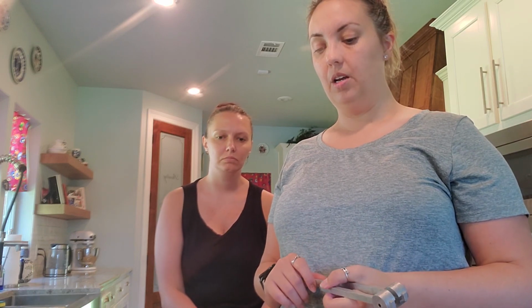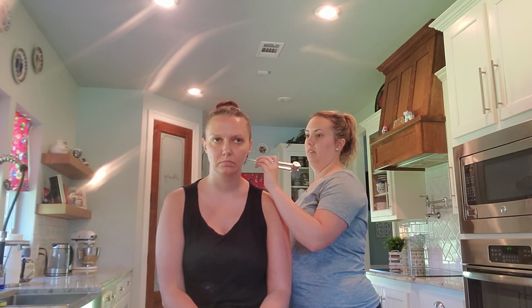Now the Rinne test. I'm going to strike my fork, place it on the mastoid process, and ask the patient to tell me when the sound is no longer heard. Then I move the prongs of the fork in front of the auditory canal and ask the patient if the sound is audible after the fork is moved. No. No. Okay. The AC is greater than the BC.